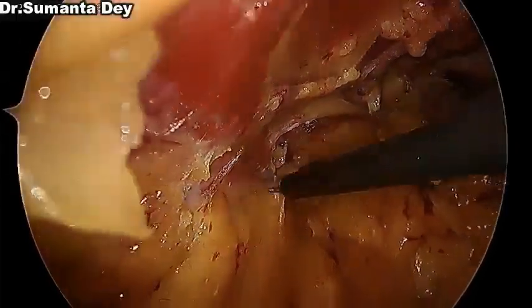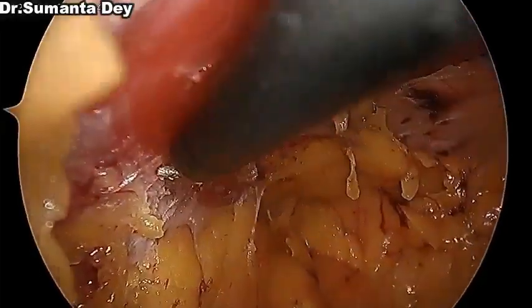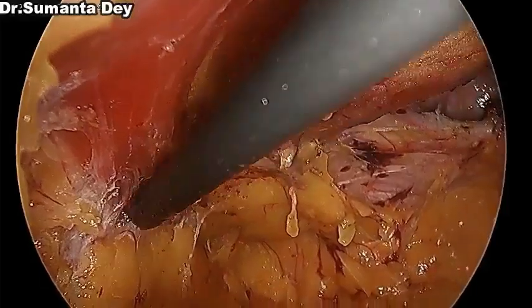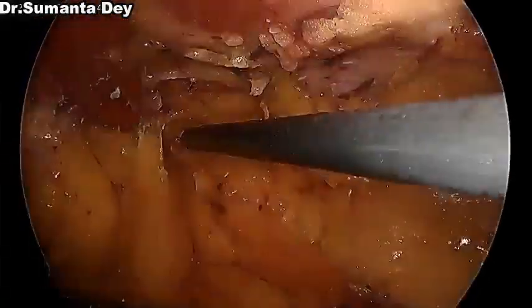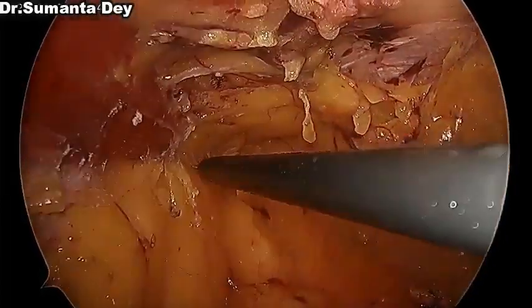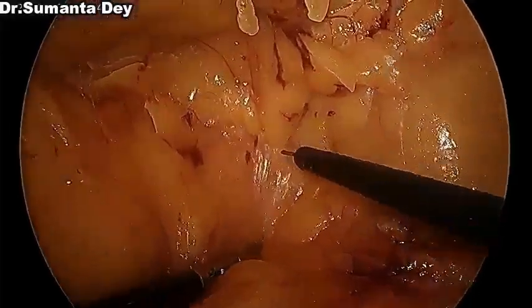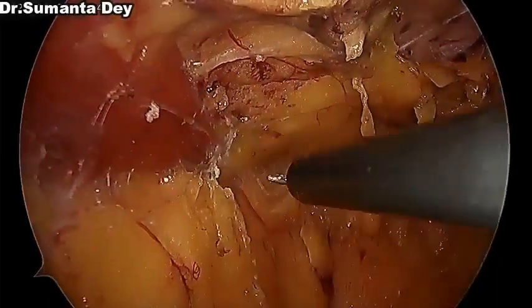Coming medially, just finding some scar tissue due to previous hysterectomy operation, and just dividing the tissue a little bit at a time. And you can see both the recti muscles together in the midline, and the defect is just lateral to the lateral border of the right rectus muscle.